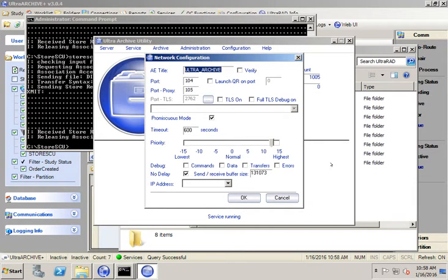So if you're doing troubleshooting and you have to do a restart of the service, make sure you go and turn the log files back on, and always save a copy of the TCP log file before you start the service again, because it will remove the old copy.